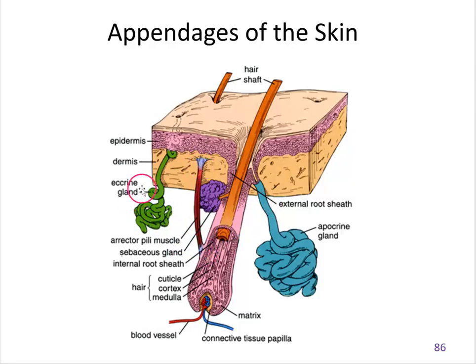We will also see sweat glands, and sweat glands are these long, highly coiled tubes, that have part of them reaching all the way to the surface. Well, if you take a two-dimensional cut through tissue, you're going to see some slice through this.